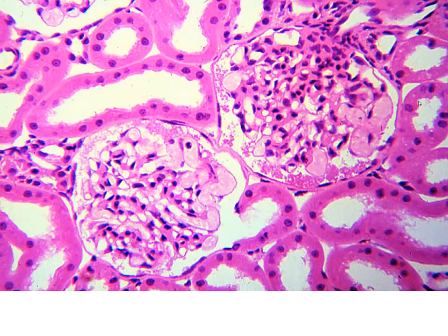Here we see a couple more renal corpuscles. We're not going to spend a lot of time here. This is not one of my favorite views simply because the lumen of these proximal tubules is just exploded. Okay, and these don't look really as tall, but look how few nuclei you can see present here versus almost every nucleus you can see here. This is a distal tubule, and the rest of these are proximal convoluted tubules.